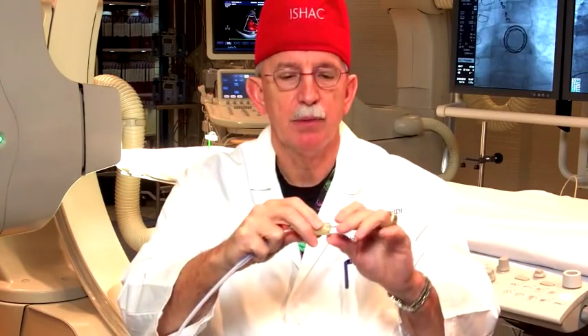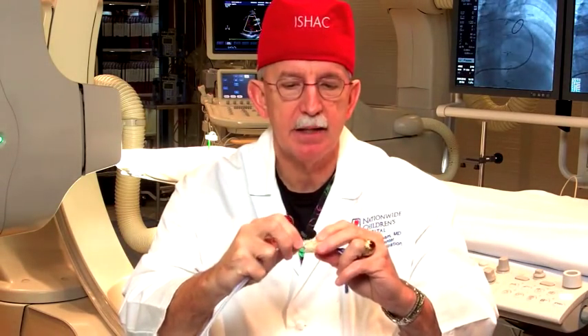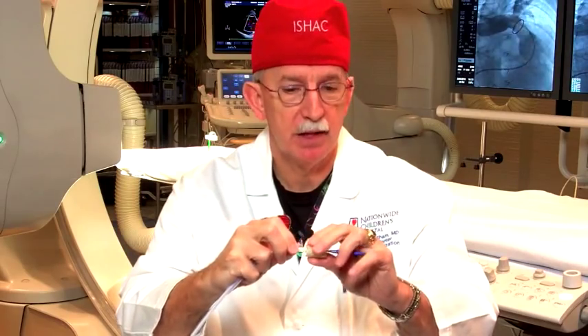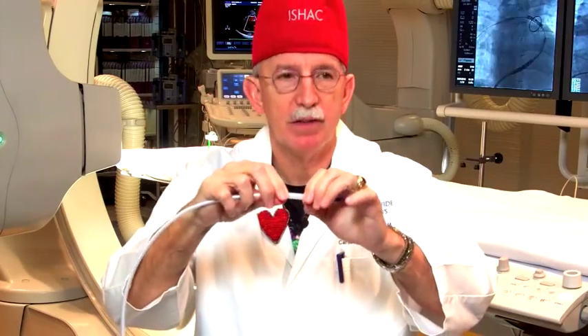Next, like all stents, we roll our fingers and crimp this down — really smashing the stent down into a very tiny, narrow profile. We keep rolling the stent and the valve tight on the balloon until it's very, very narrow. Then we take this plastic covering and push it up over, so now the valve is inside the plastic covering on the balloon catheter.